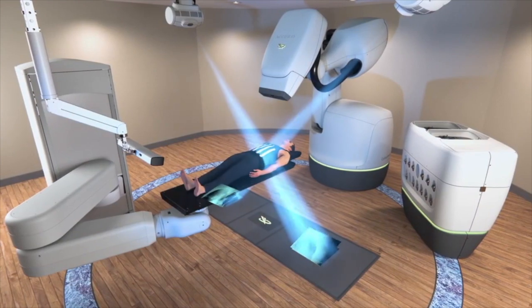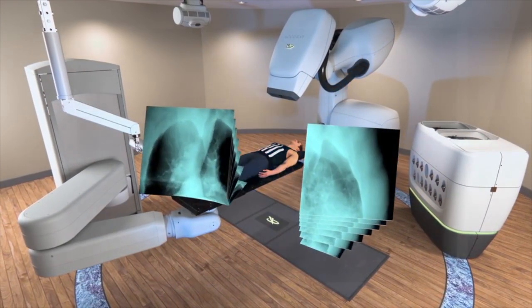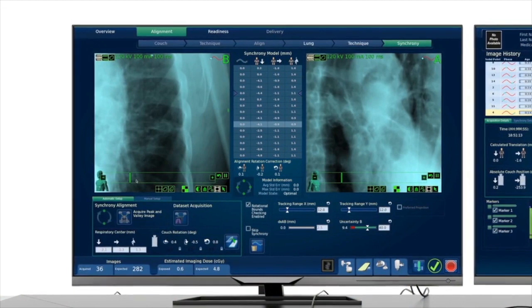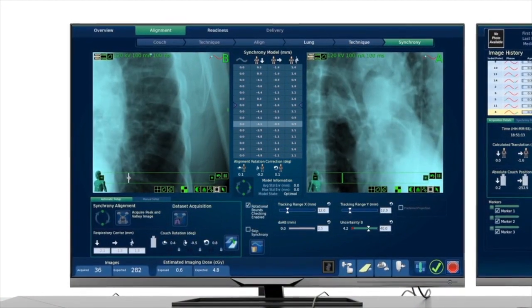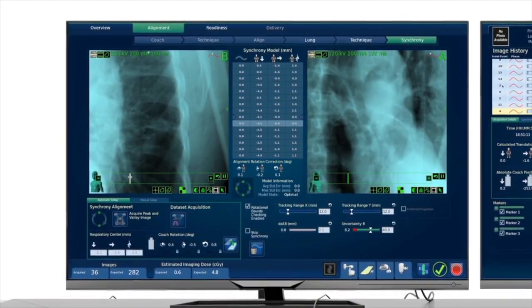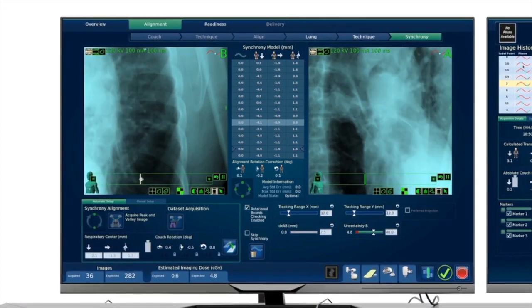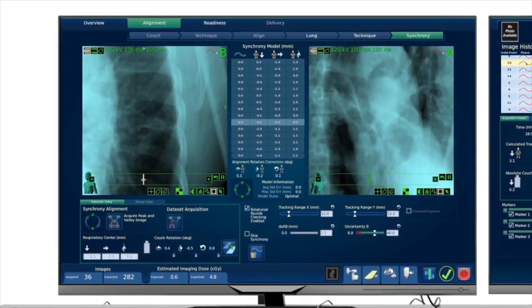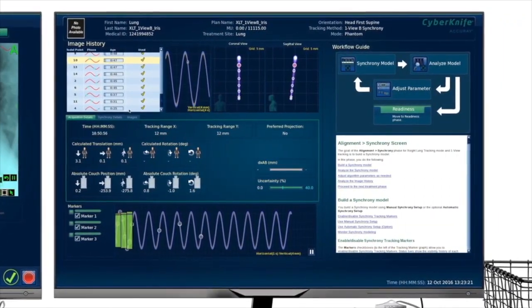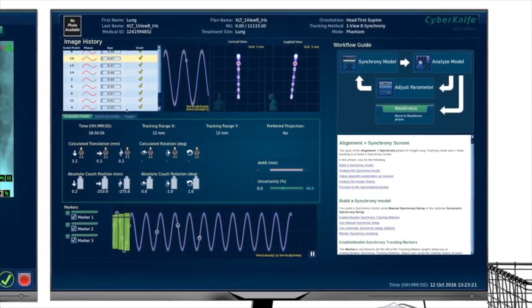Before initiating treatment delivery, the system automatically acquires a series of rapid X-ray images that represents the entire respiratory cycle. Combined with the breathing motion captured with the optical camera, the system builds a personalized correlation model that predicts the tumor location and motion.